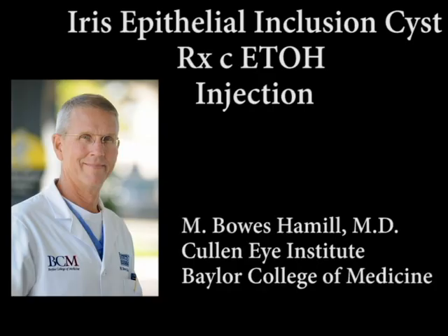It is very important to appreciate that this technique works only for those cysts that are closely applied to the corneal endothelium, such that you can access the cystic space directly through the cornea or the sclera with no intervening aqueous. If this technique is employed for a cyst that is on the iris but not connected to the cornea, you run a very high risk of rupturing the cyst, and I would recommend strongly against it.